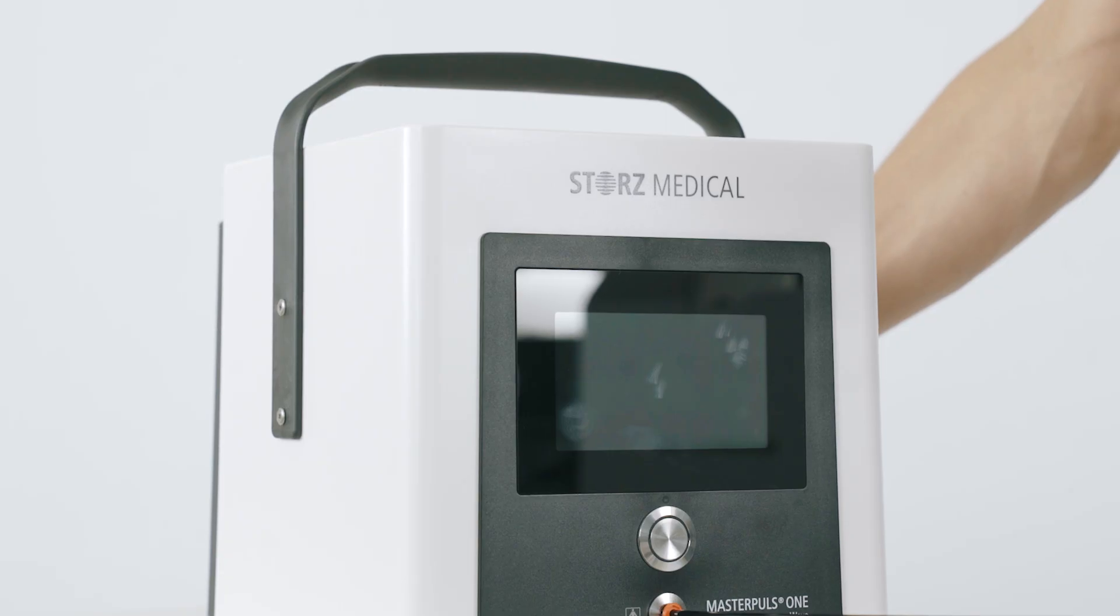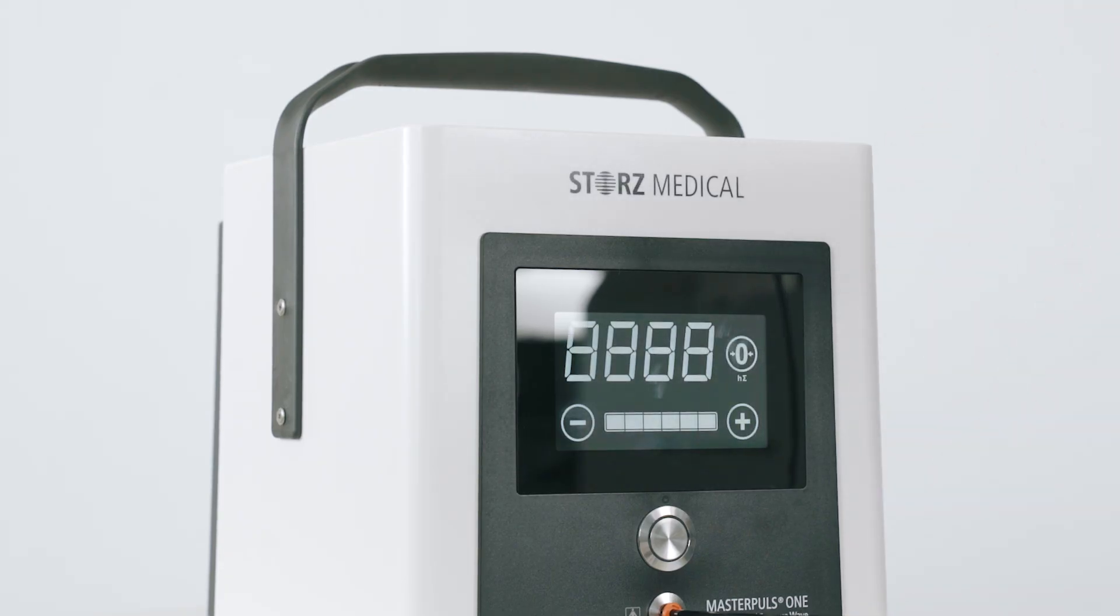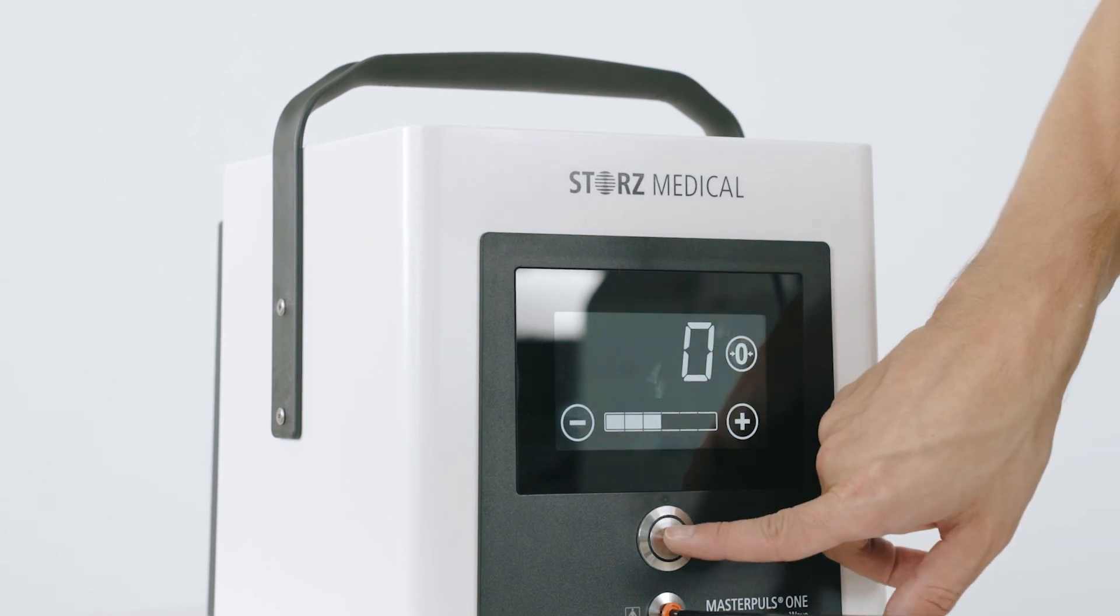The machine is easy to operate. Simply turn on the power at the back of the machine, select Energy Level 3, which comes standard, and press Start to begin.